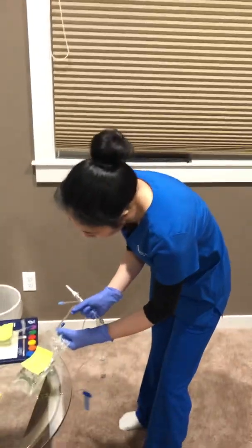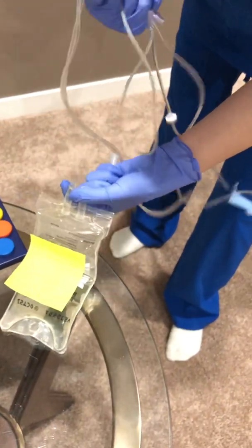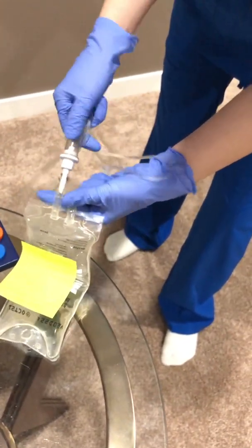Alright, so I open this cap and open this cap, sterile to sterile.